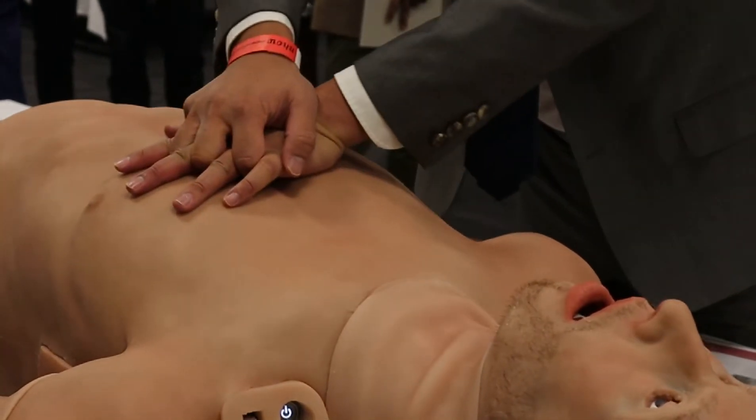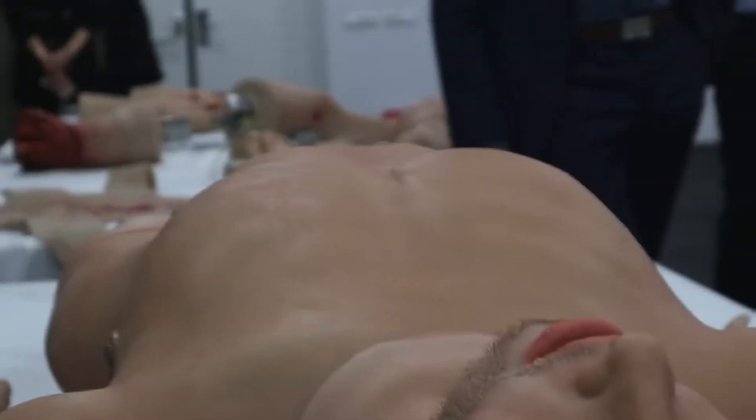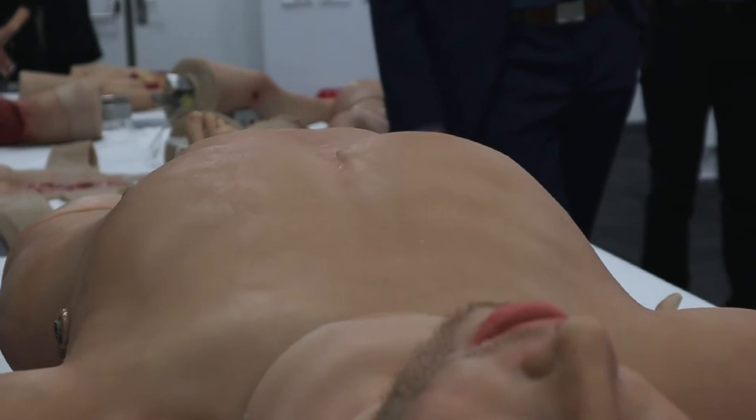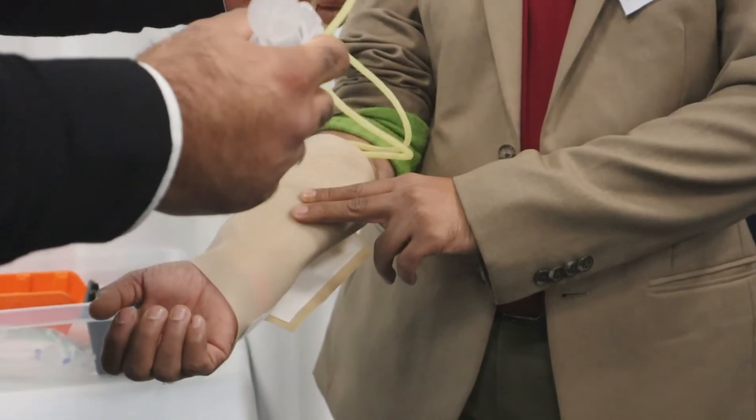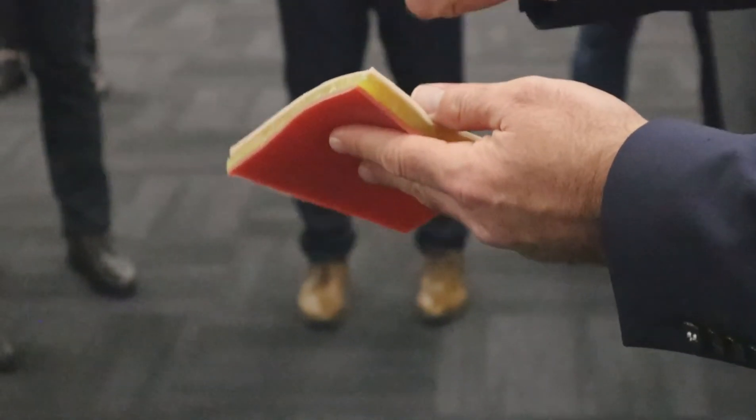It's quite impressive — you feel the bone structure, you feel the flesh structure, and there's a skin around it. It is silicon as well, but we reinforce it so that it is possible to make the surgeon feel like a real patient.